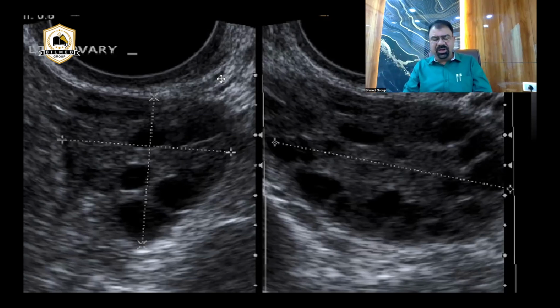Now see the practical implementations. Practically, I will not say increasing or decreasing the PRF, rather adjusting the PRF. Let me put an example. You are taking a scan and you have to rule out whether we are dealing with an RPOC or a blood clot. An RPOC, if it has a flow, that will be a slow flow. For slow flow, I have to adjust the PRF.